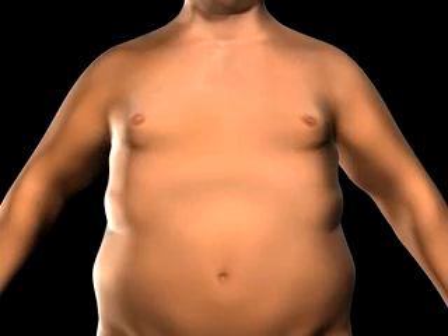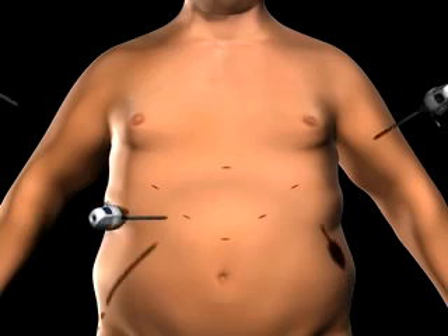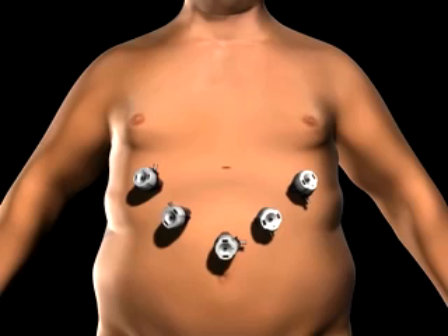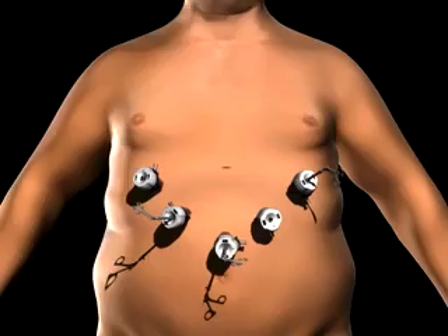To gain access to the abdominal cavity, small incisions are created on the abdomen. Trocars, which serve as passageways for surgical instruments, are placed into the incisions. Surgical instruments are passed through the trocars to access the abdominal cavity. The surgeon examines the abdomen using a laparoscope, or video camera.